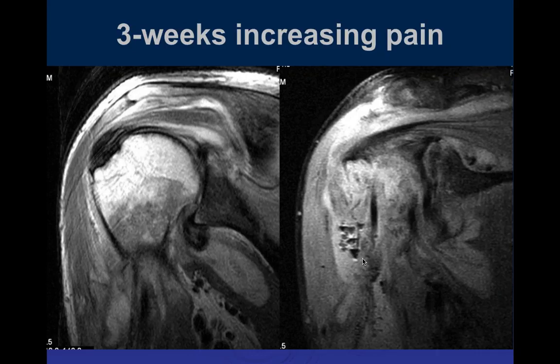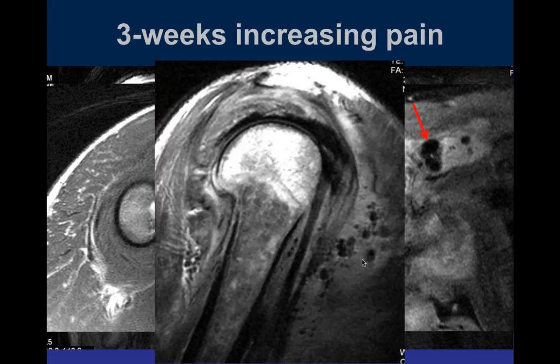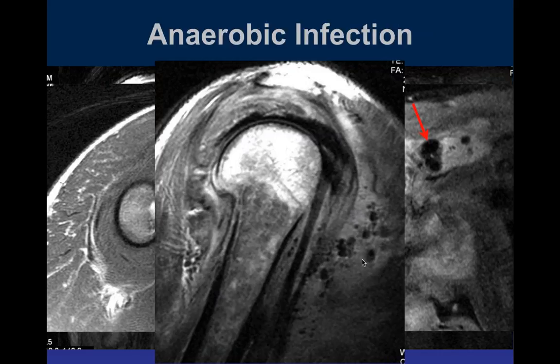Three weeks later, coronal T1 and PD fat-sat images show persistent edema within the humeral head at the supraspinatus attachment and continued irregular edema within the subacromial-subdeltoid bursa. Low-signal foci within the fluid — representing gas — are now visible. When air is seen in soft tissues in this setting, one must strongly consider anaerobic infection rather than staph aureus. This was a mixed infection; the patient initially grew staph aureus but subsequently developed an anaerobic component.